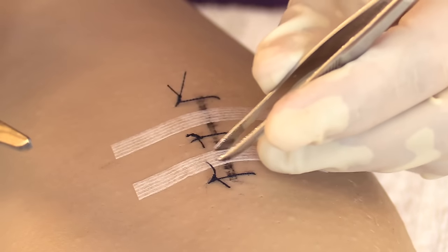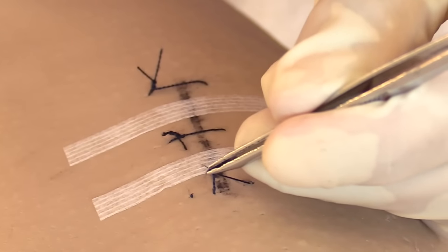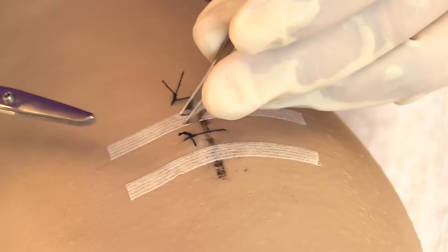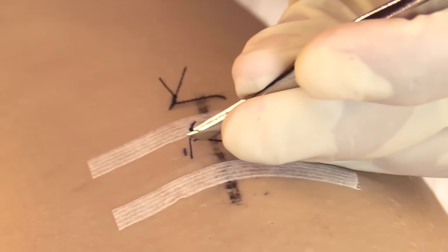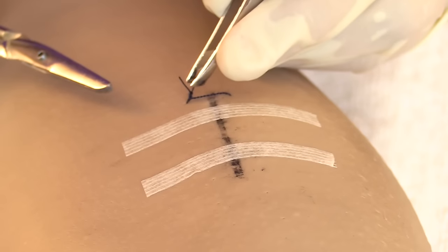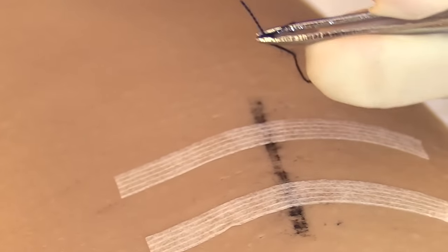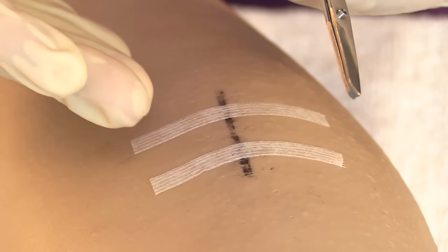Now remove the remaining sutures. Grab the knot, cut underneath it, pull up, then pull over the wound, and analyze the thread — it should look intact. Drop it in the gauze. Repeat the same process for each remaining suture: grasp the knot, cut underneath, lift up and pull over, inspect the thread, and drop it in the gauze. Continue until all remaining sutures are removed.